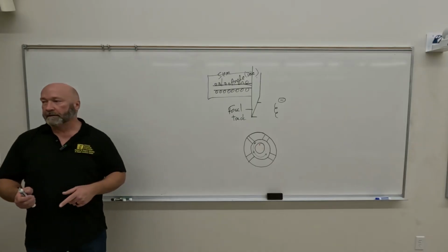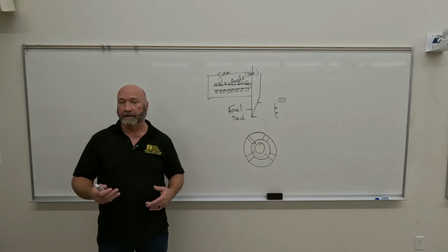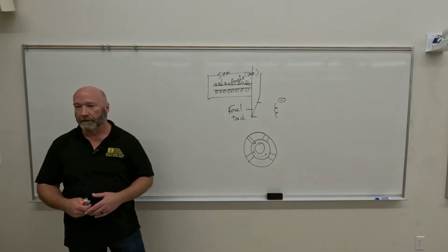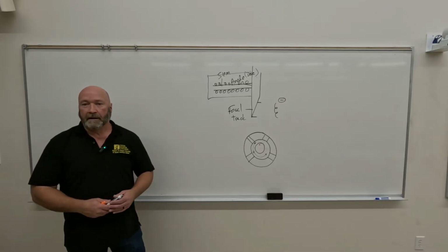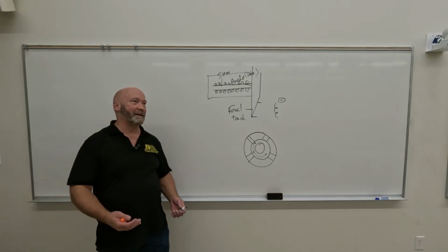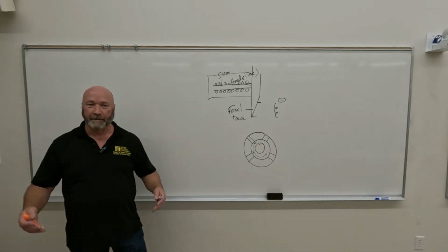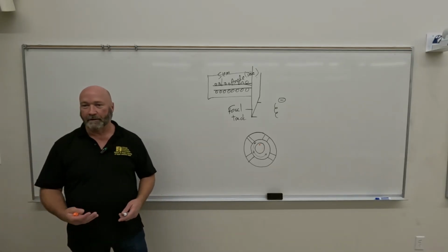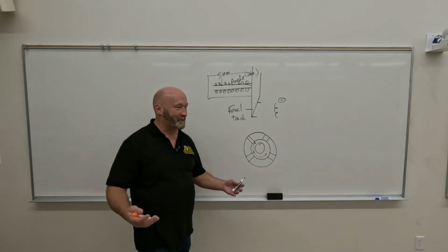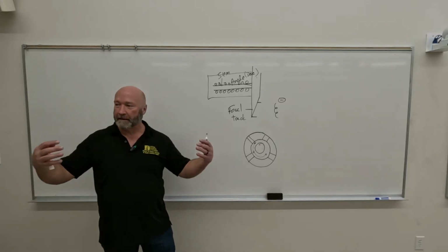Tungsten does not warp when you heat it. It's one of the few things that does not change, well, until you get to the point of melting it. It doesn't expand, it doesn't contract whenever it's heated or cooled. Almost everything else does, right? So you heat water, well, water's a bad example. You heat water, what happens to it? It boils, it vaporizes, right? So it gets bigger. You get water cold enough, and what does it do? Freezes. And unfortunately, it expands there too. So water's weird, but everything else, if you heat it up, it expands. If you cool it down, it contracts.